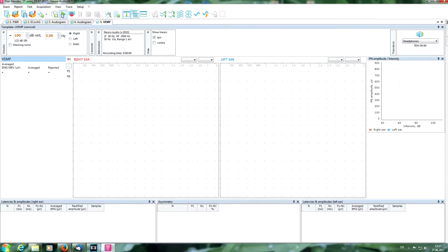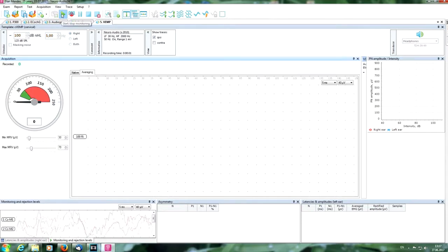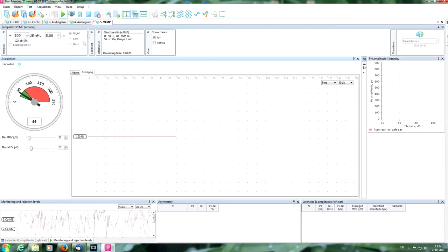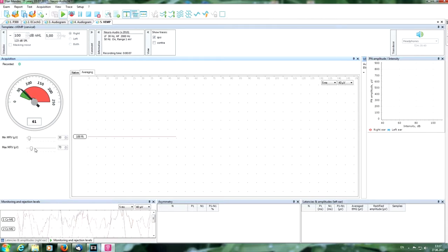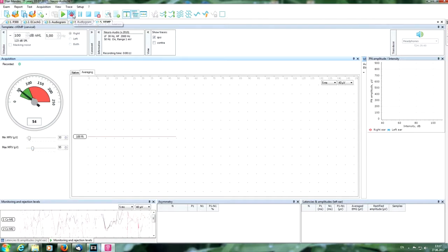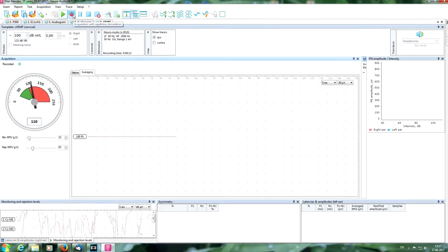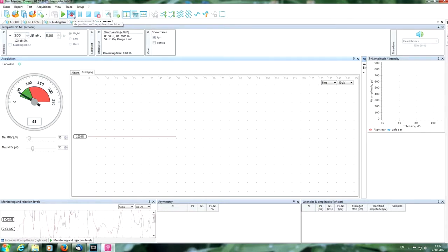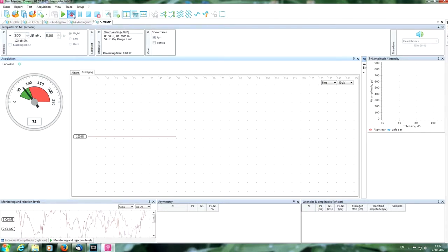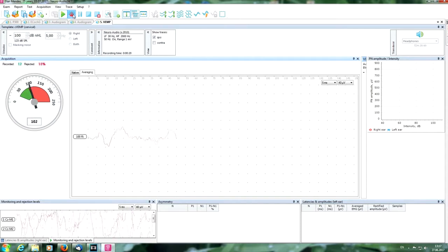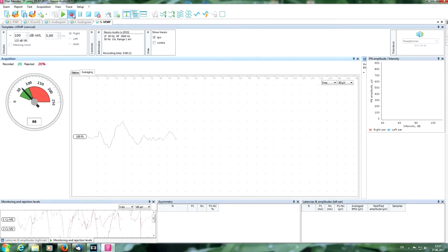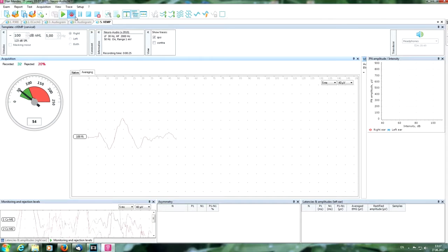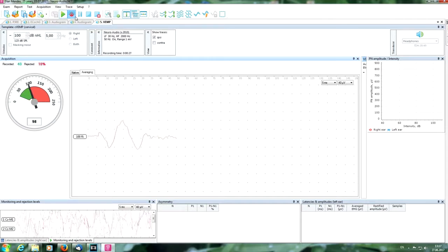Monitor the signal of EMG and teach the patient to contract the muscle. Here you can see the monitor of biofeedback on the EMG signal. When the patient contracts well within the green border, you can start the stimulation. Ask the patient to contract the muscle the same way during all the stimulation. We can see a good response.